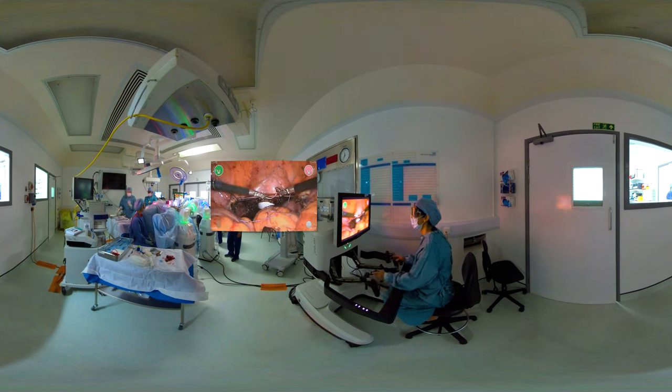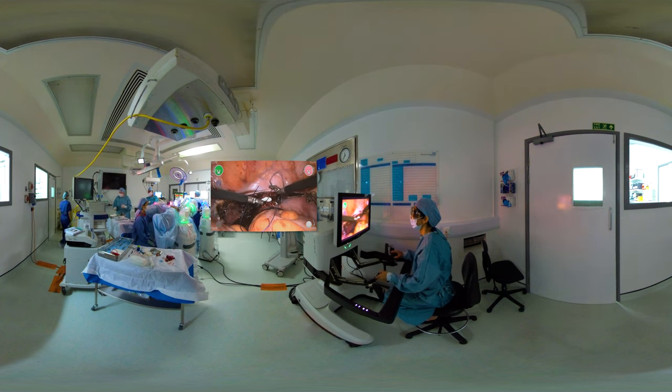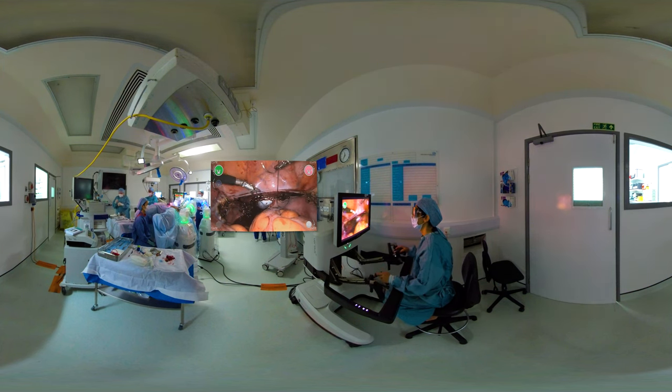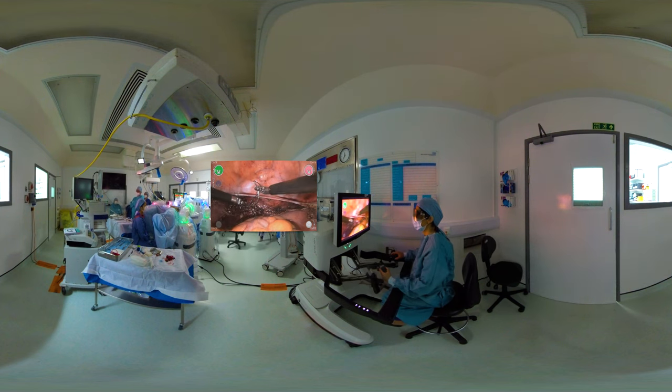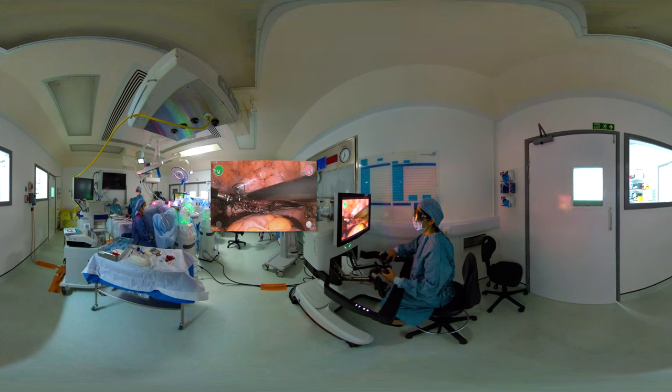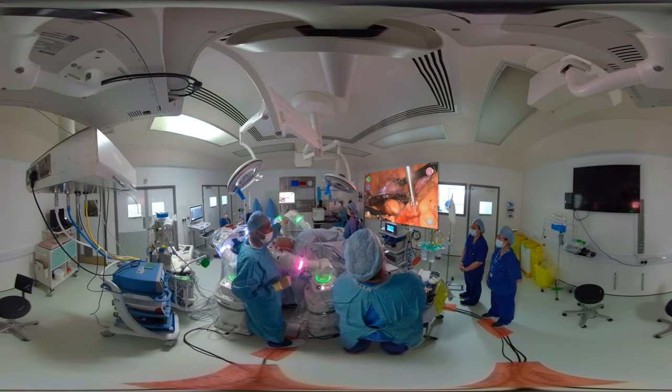We will now deliver the cervix and uterus vaginally. I prefer to use intracorporeal suturing with number one Vicryl and I use about three or four interrupted sutures to achieve hemostasis. You can see the movement of the arms there at the console. The open console design is particularly useful so that I can communicate with the rest of my team, the anaesthetist, and I know what's happening in theatre. Of course for training and teaching there is a facility for people to sit behind you and watch the surgery. I also feel that suturing is made much easier given the instruments compared to laparoscopic surgery, and here's the vaginal wall which has come together quite nicely.